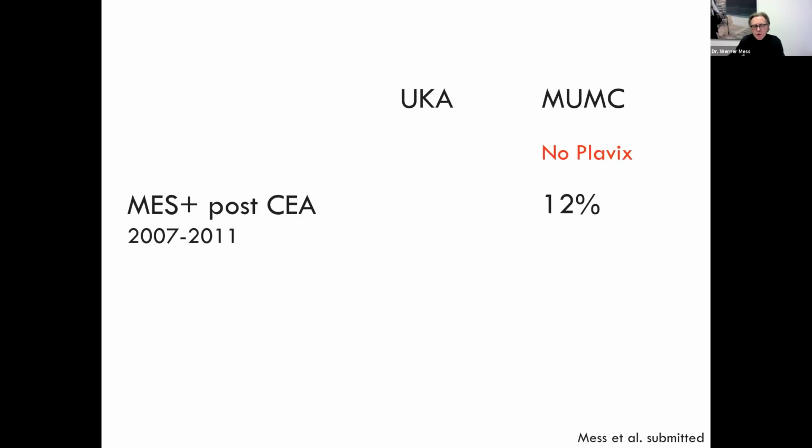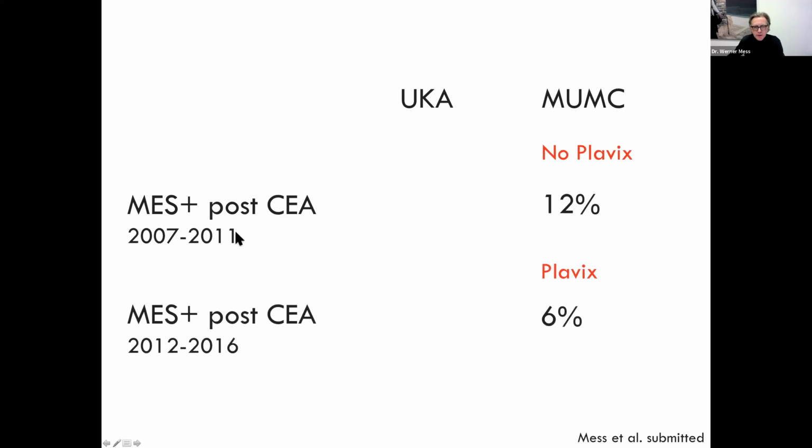We then looked for changes in time. So in this hospital, there was no Plavix, no clopidogrel during this era. But then in 2011, the surgeons administered preoperative clopidogrel due to the study from Leicester. And you can see that indeed the incidence of emboli positive patients halved. The other hospital didn't do anything, and they just stayed pretty low. So I think these data show us that indeed the preoperative clopidogrel works.